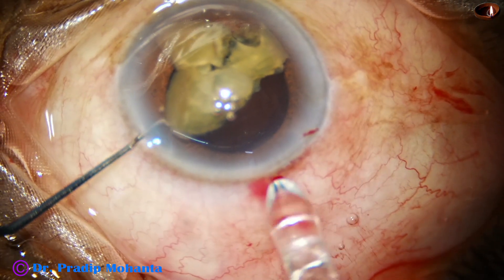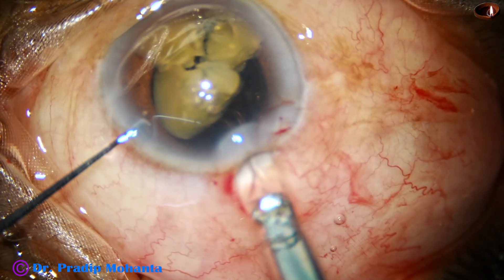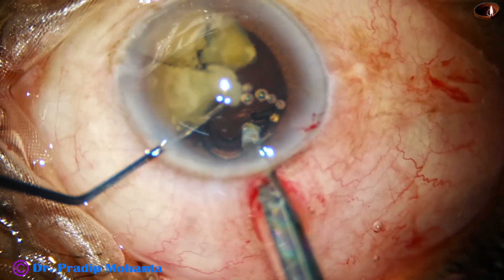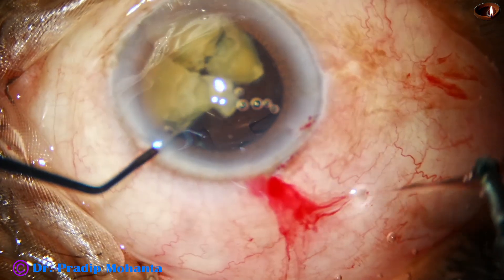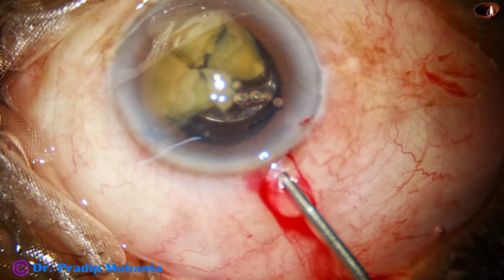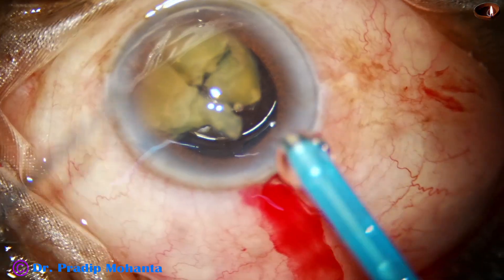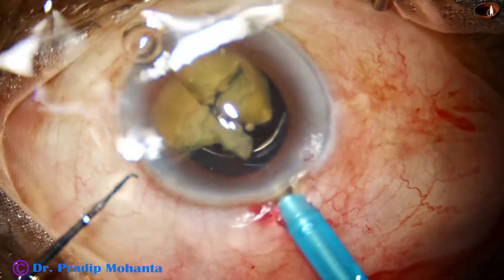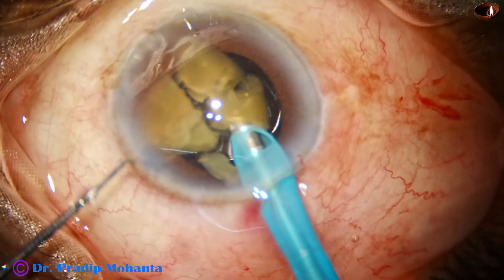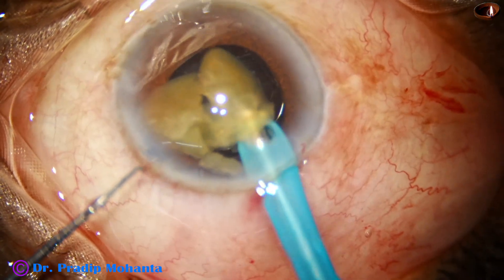I can easily implant the lens in the bag and support the posterior capsule — IOL scaffold technique comes into play. Here goes the intraocular lens. The leading haptic goes underneath the capsule, under the nuclear fragments. It goes in the bag and the trailing haptic also goes in the bag. Now the posterior capsule is protected 100%. I go again with the handpiece and start emulsifying the nuclear fragments. At this time we have to take care of the intraocular lens as well as the cornea.